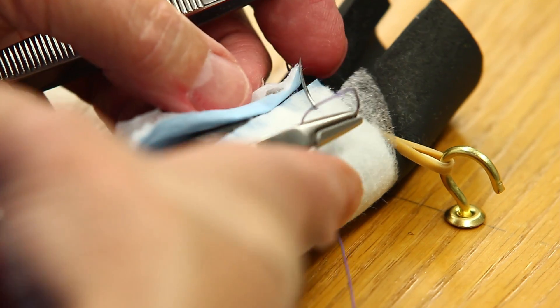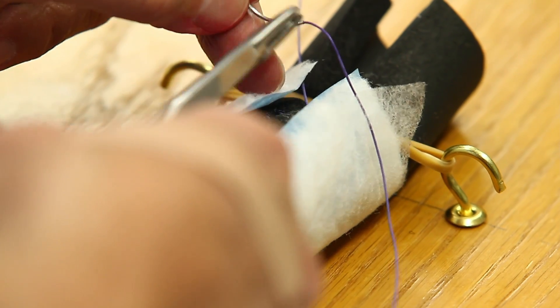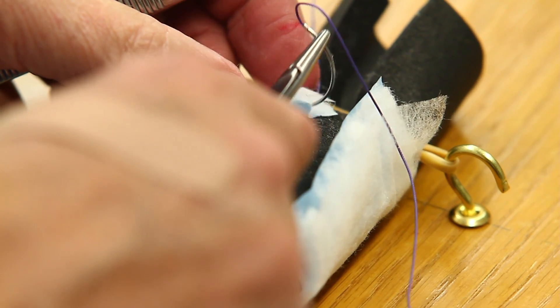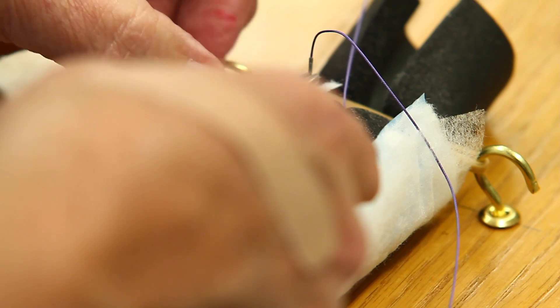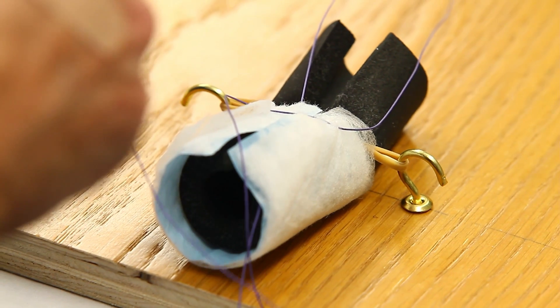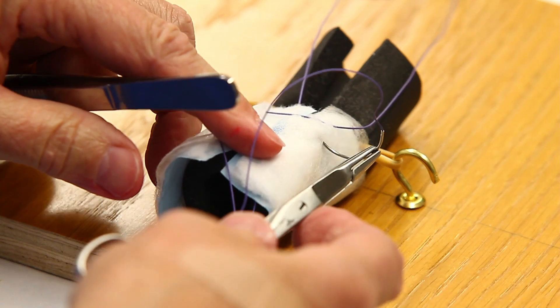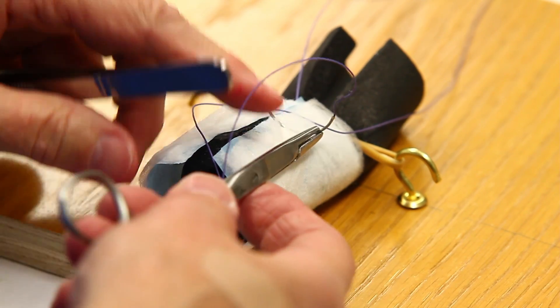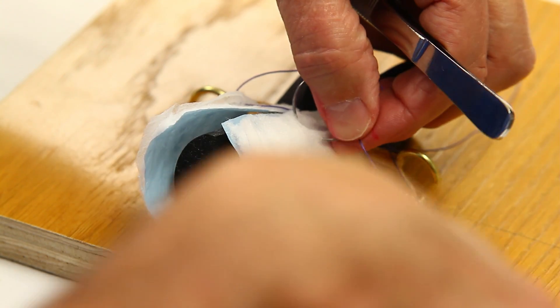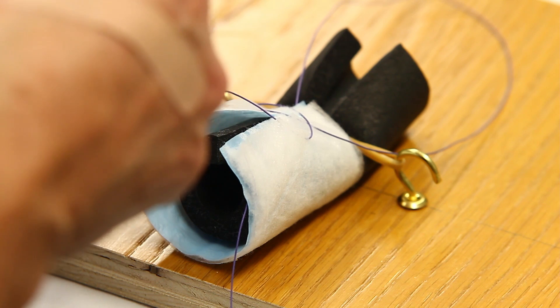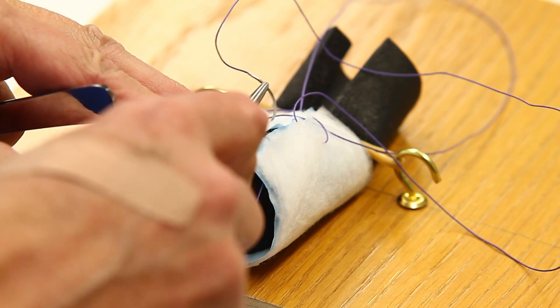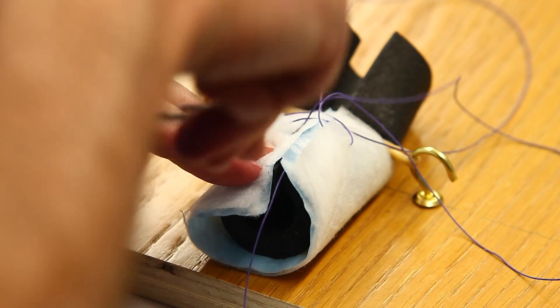Delicately pull the needle up, go across, into this tissue layer, carry it up. Skim along the tissue layer, picking up the delicate internal rectal sphincter. And cross over to the other side, follow the curve of the needle.